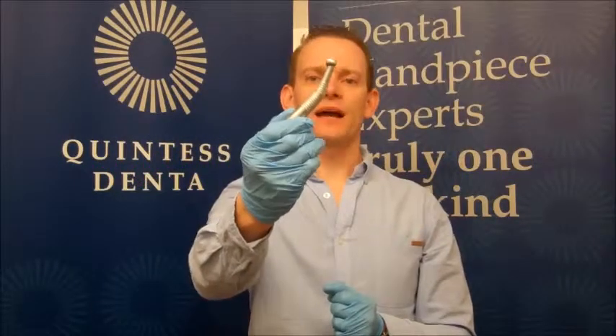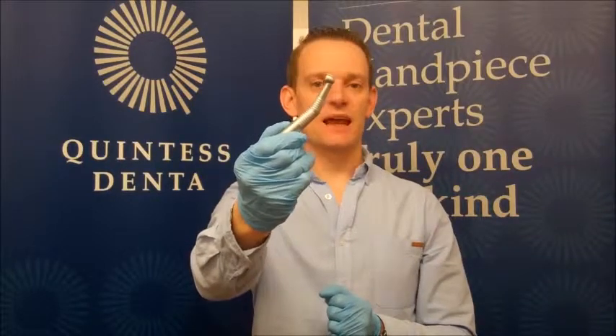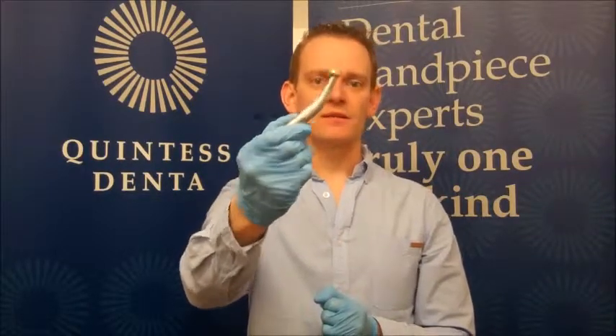Here we have a KAVO high-speed handpiece. It's very important that this handpiece is cared for and maintained properly to ensure that it lasts a long number of years.